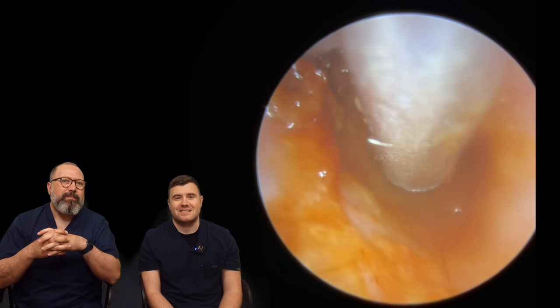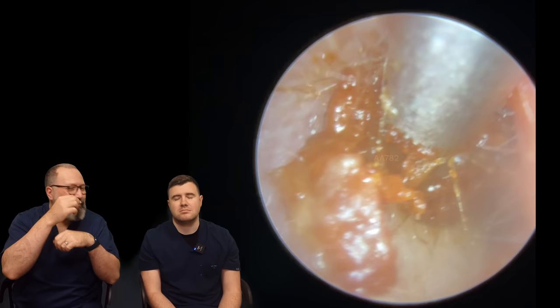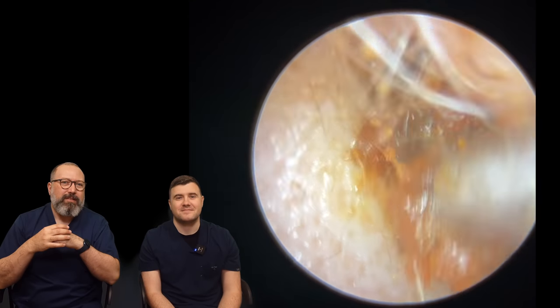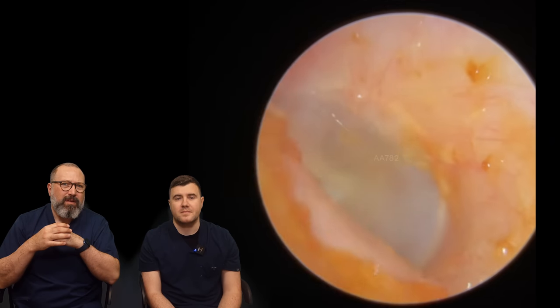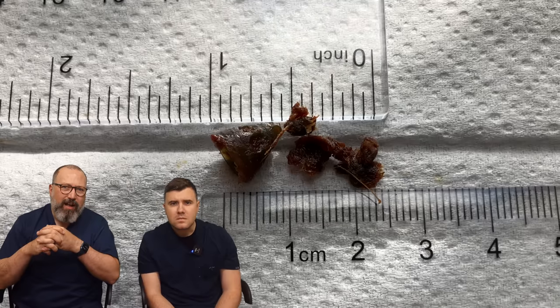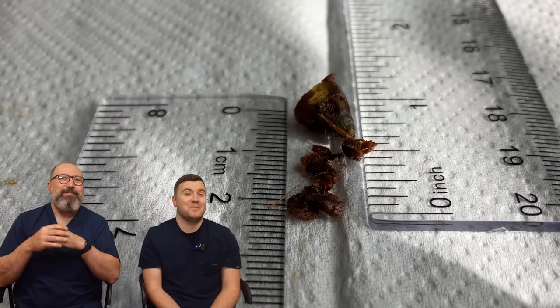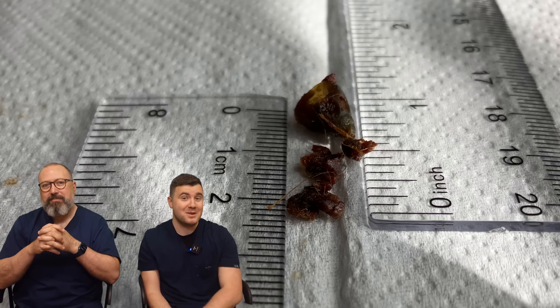That's coming away. You can see it's much wetter — that's what's nice when it does that, you see the whole thing coming out. Otherwise it starts slurping into the suction tube and you think, oh no. There we go — I think we've got the fine end tube on here now, because the entrance to the canal is just a little bit narrower. Oh, there we are — there's the eardrum, nice and healthy. This is what it looked like beforehand, and this is what it looks like afterwards. You can see a very different ear canal. There's the wax — and I think the dome is tucked into the middle of that wax. That's the dome we pulled out, all embedded with wax. So that was two and a half centimeters — pretty much an inch, spot on.